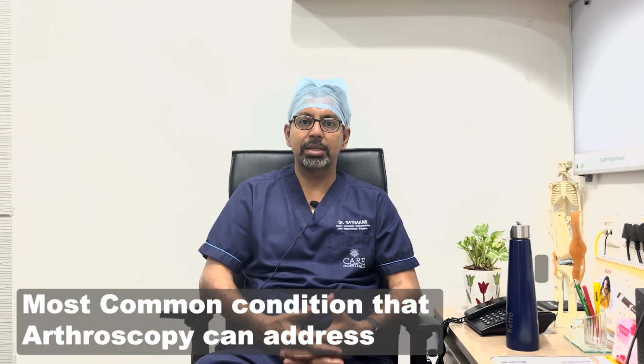Depending on MRI, we can rely on the diagnosis about 70% of what's happening inside. But with arthroscopy, peeping inside the joint and seeing with the naked eye, we'll know what the problem is and where it exists. At the same point, we can correct it also. So it's not a major surgery, it's a safe surgery, and there's no scar with that, it's only a keyhole operation.